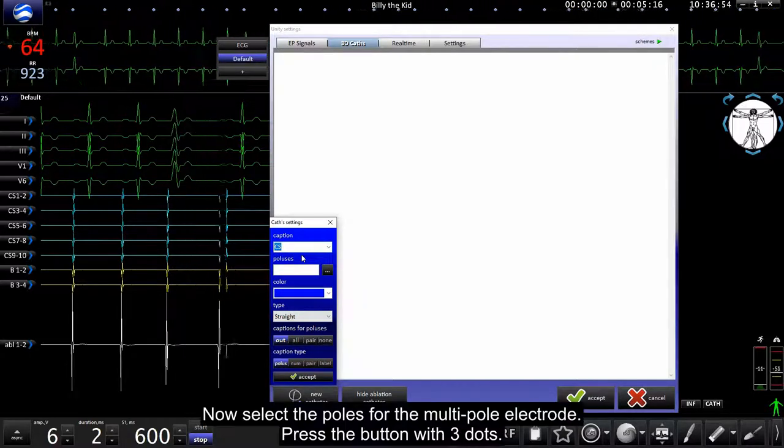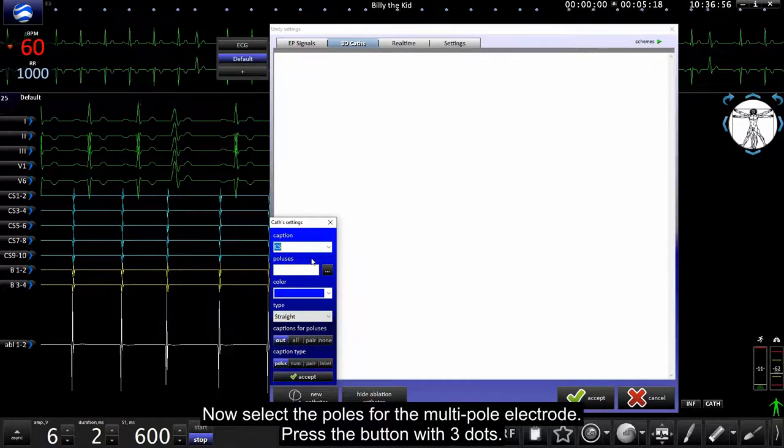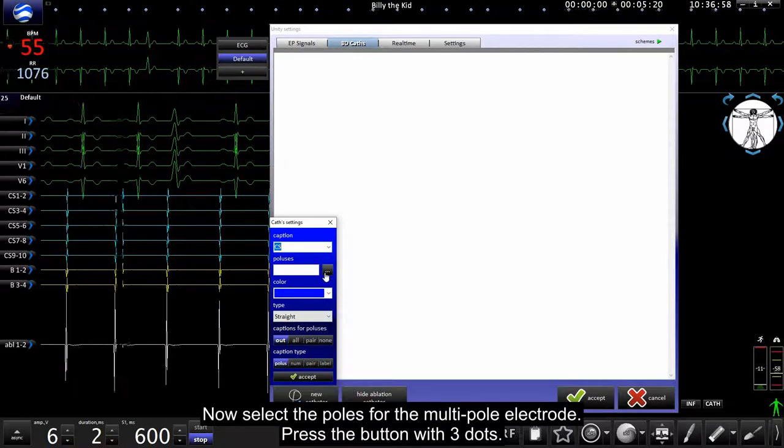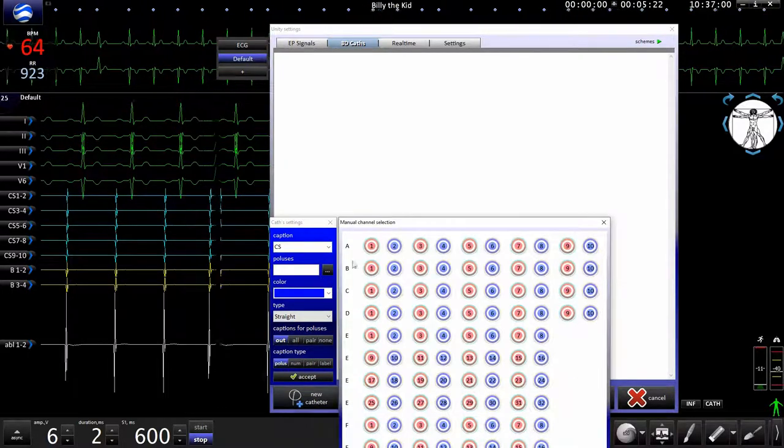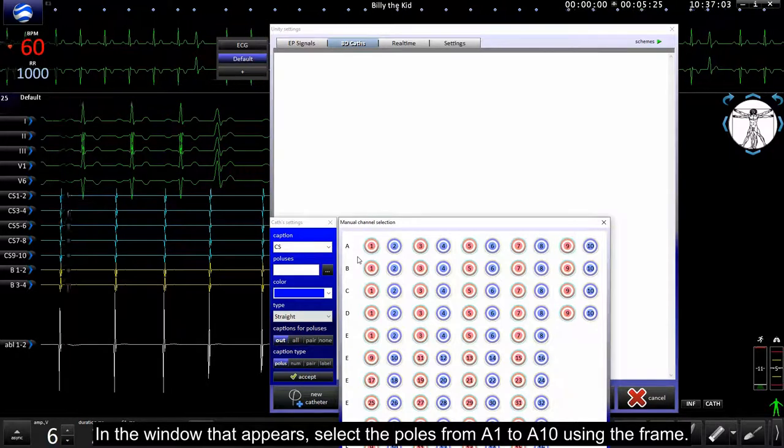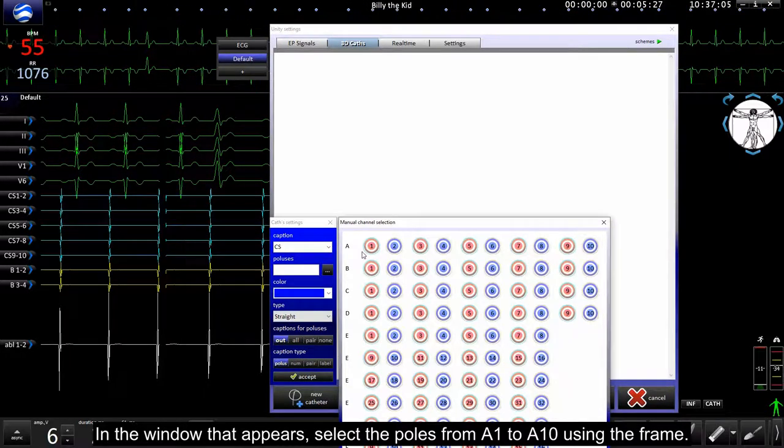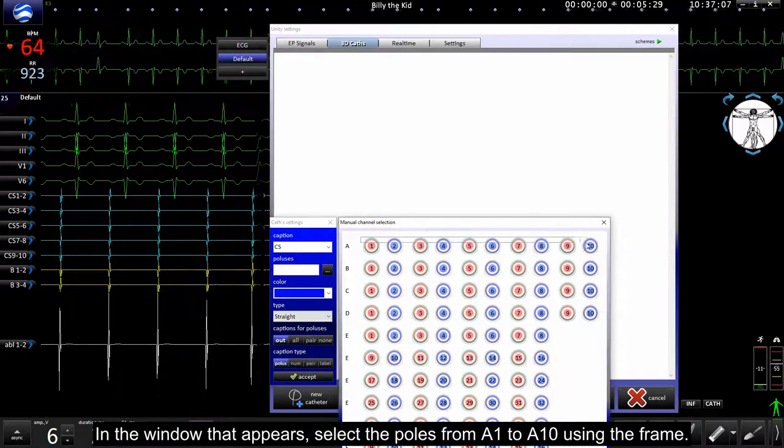Now select the poles for multiple electrode. Press the button with three dots. In the window that appears, select the poles from A1 to A10 using the frame.